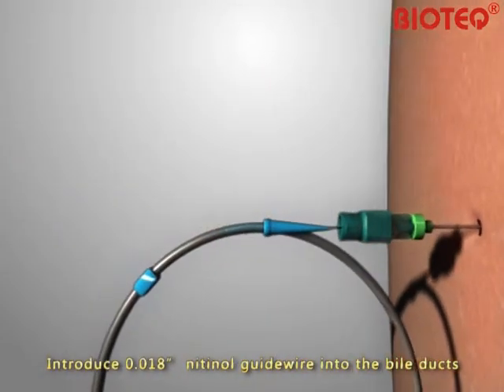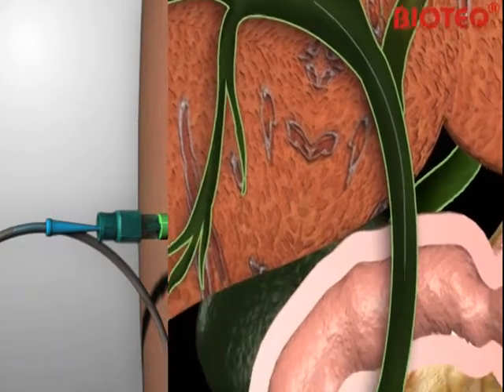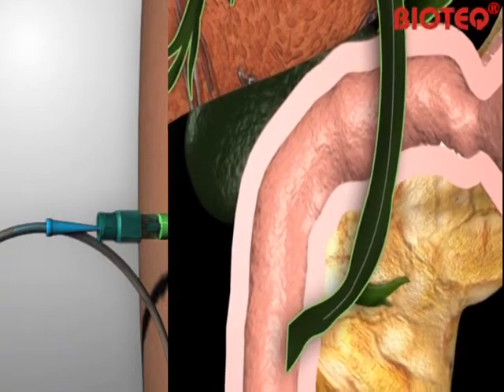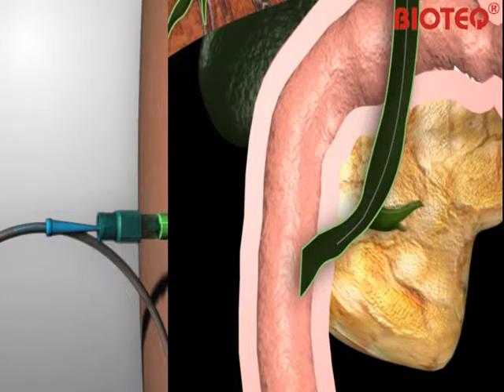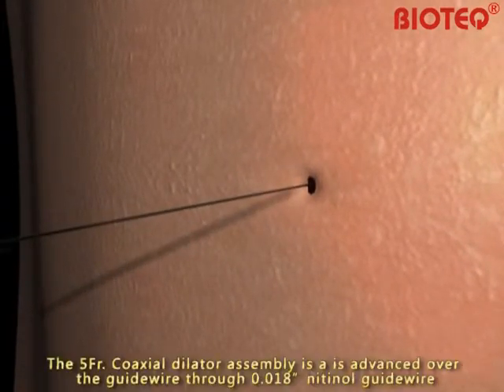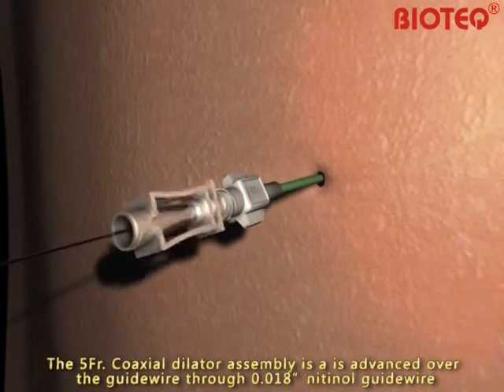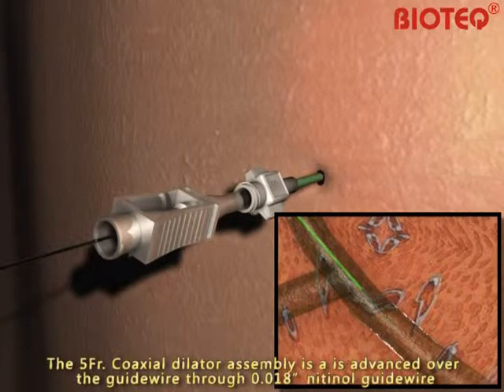Introduce the 0.018-inch nitinol guide wire into the bile ducts, then remove the 21-gauge introducer needle over the guide wire. The 5-French-gauge coaxial dilator assembly is advanced over the 0.018-inch nitinol guide wire.